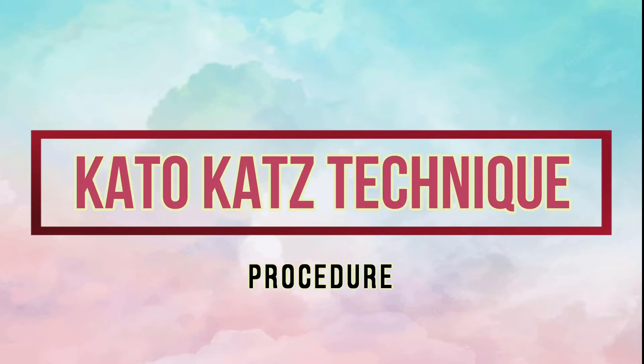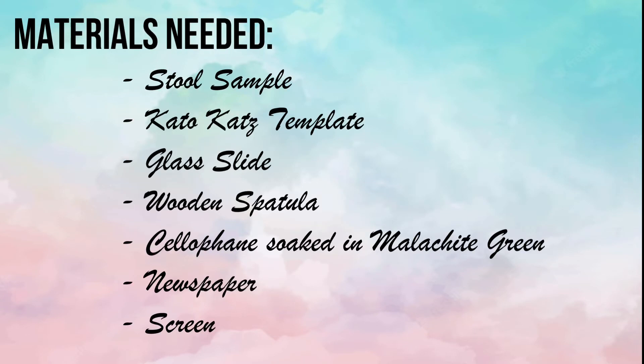Kato-Katz Technique Procedure. Materials needed: Stool sample, Kato-Katz template, glass slide, wooden spatula, cellophane soaked in Malachite green, newspaper and screen.